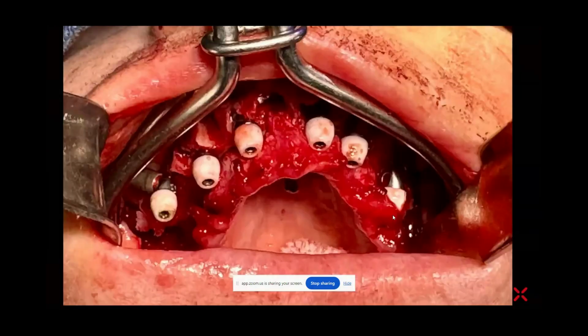This was her maxilla. We did a full digital workflow. I've been digital for the last 5 years. What's great about TRI is you can use it with the PIC, the iCam, or the micron mapper pretty soon. I know right now with the micron mapper you can't. There's some issues with the scan bodies, but that'll be within a couple of months.